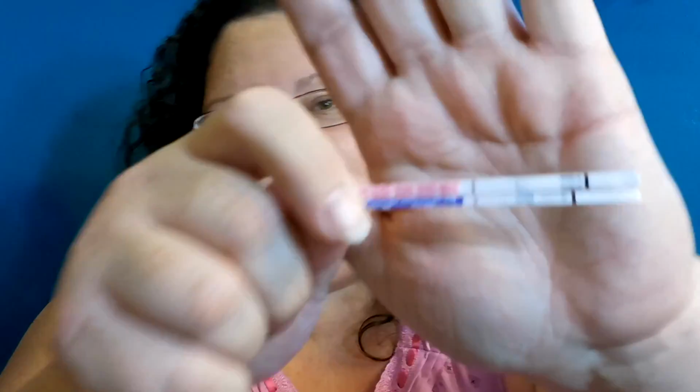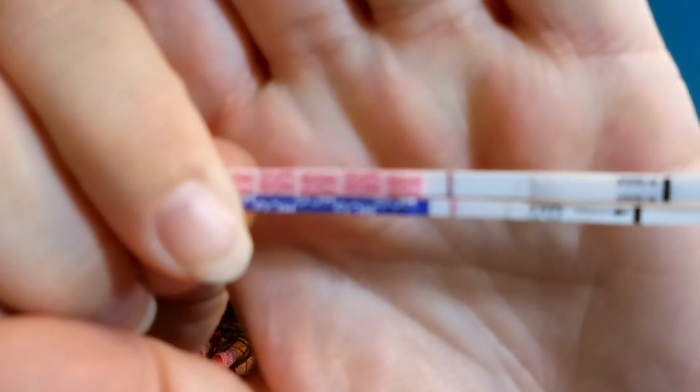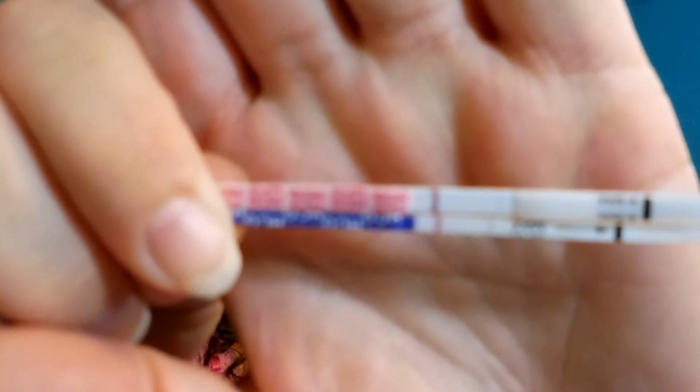But let me show you the difference in size. I've talked about it before. The BFP ones are the biggest ones that I have seen. And as long as you don't get those cruddy ones that they were selling for a while there, the ones that give false positives, and they have stopped selling them, but you may still have some of them in your drawer, don't use those. But those are the biggest, the OneFos are second, and then these are those teeny tiny ones. I hate the teeny tiny ones.